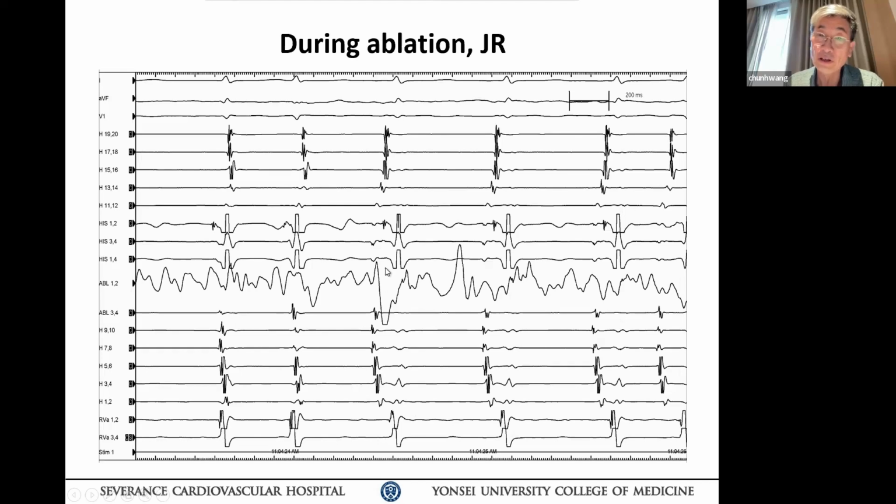This is different than your AVNRT rhythm, right? Agree with me? Especially look at your last two. Why is it varying? Does the activation sequence matter? Yes, it matters. This is an automaticity rhythm. That's why the exit is varying, because you're hitting it. Now your activation is exactly the same as AVNRT. You're triggering AVNRT by burning it. That's triggering, so you're not in the right spot.